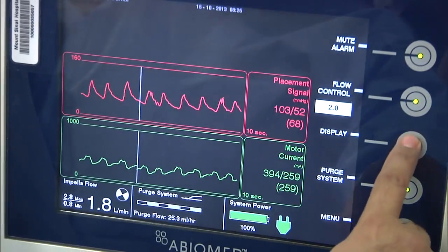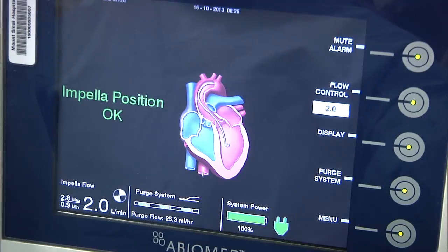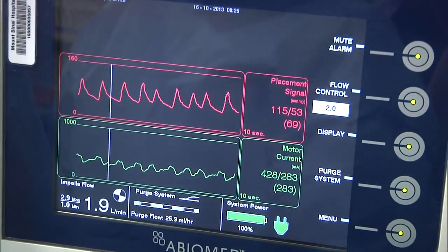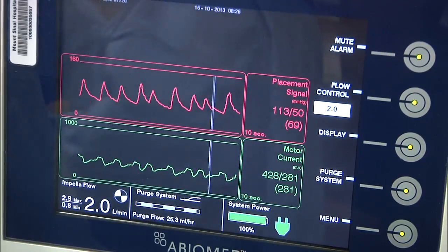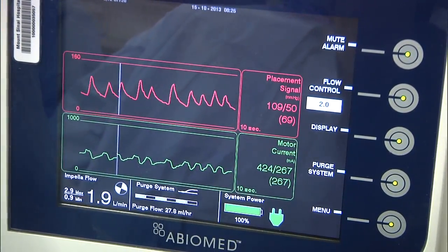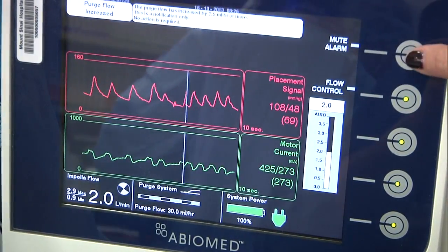In the past, you used to have this dextrose solution, everything comes very simple and easy as say that we are ready to start. And that actually has shown with the recent trials of the Impella insertion time, balloon pump takes about total to get ready about 90 seconds and so, and Impella takes maybe just double the amount, 2 to 3 minutes for fully ready. And this is exactly, you saw it in this case, actually we did even less than a minute.